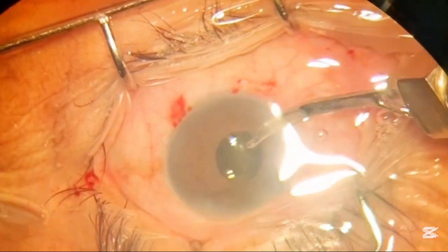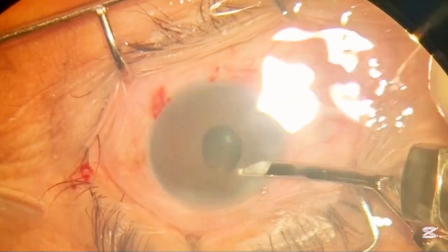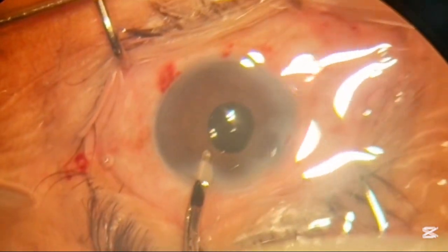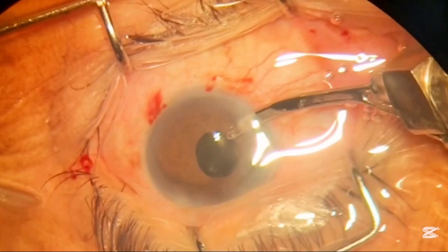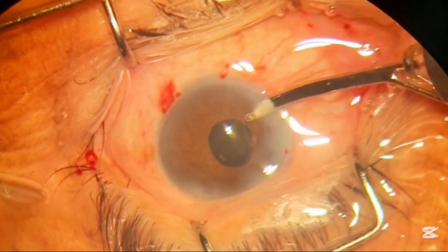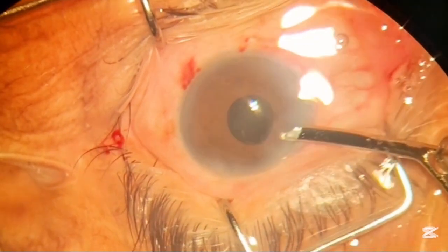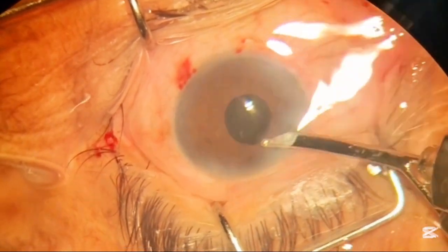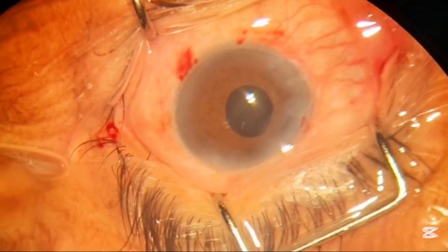Now we will remove the gel from the anterior and posterior segments. You can see the floppy iris moving like waves and the shiny cornea with the shine of the lens visible. We are now done with phaco emulsification and will perform AC lavage to remove all the gel and debris from the anterior chamber. The lavage is very important — sometimes fibers left in the posterior and anterior capsule take time to come into the tip of the Simcoe cannula, so keep hydrating the anterior chamber for maximum results. The debris on the back of the corneal endothelium will also be removed. Hope you liked the video, thank you very much.